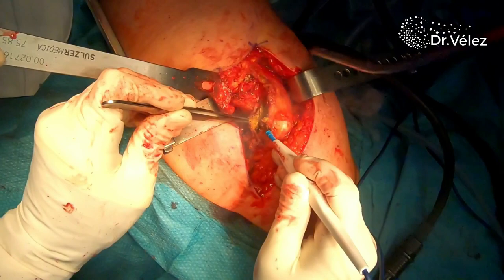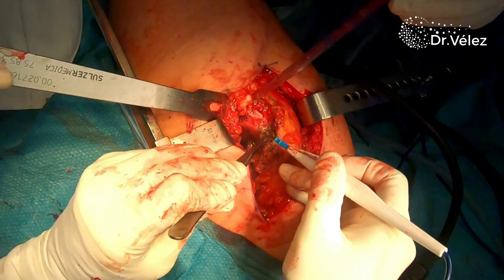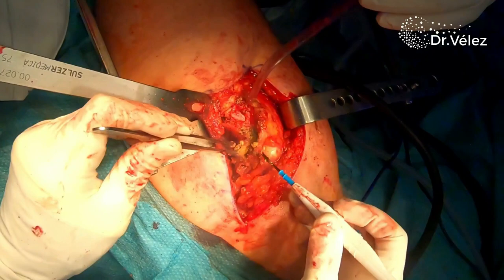We take this moment to clear again some of the remaining external rotators to prepare for femoral canal broaching and reaming.